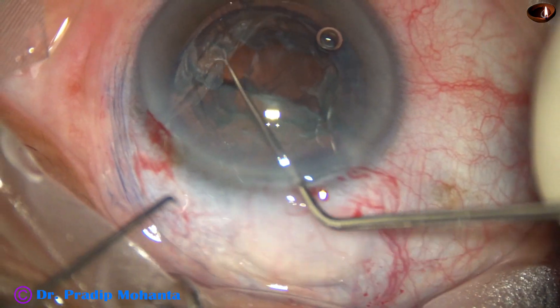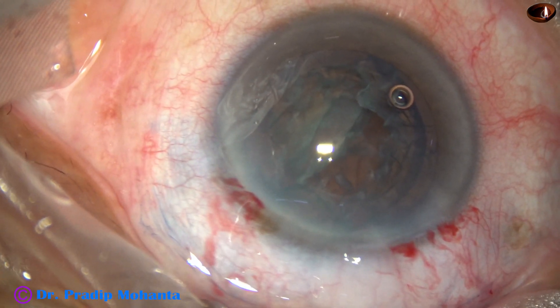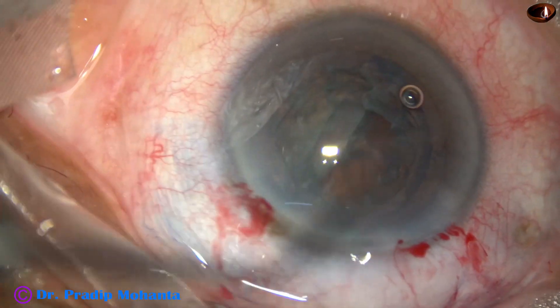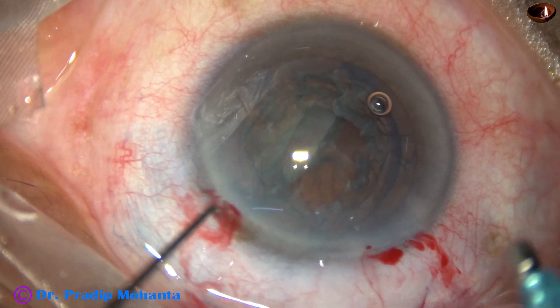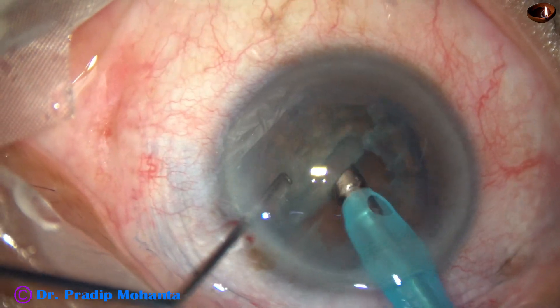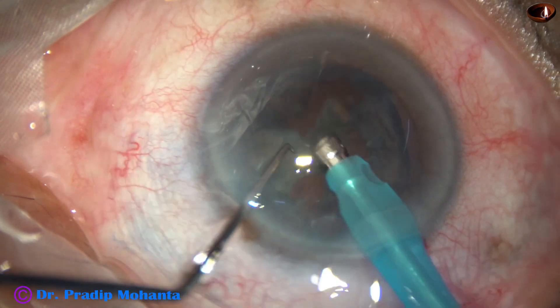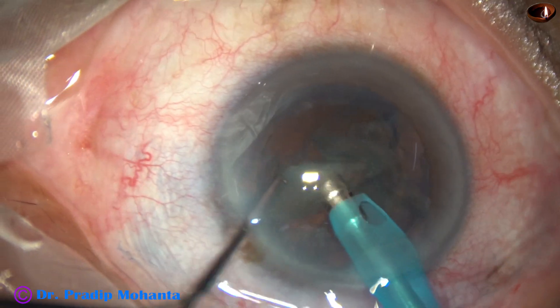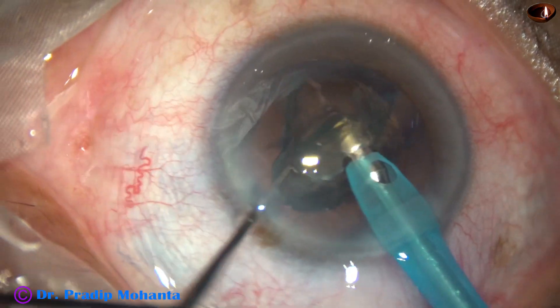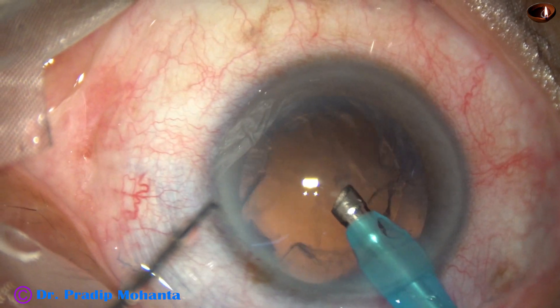In this case, I could not rotate this hemi-nucleus, so it came out. I placed it in such a way that I can easily catch it and chop it. The phaco needle holds the hemi-nucleus and chops it into pieces. The pieces are emulsified — ultrasonic energy used is 50%, flow rate is 45 ml per minute, and vacuum is 450 mmHg.